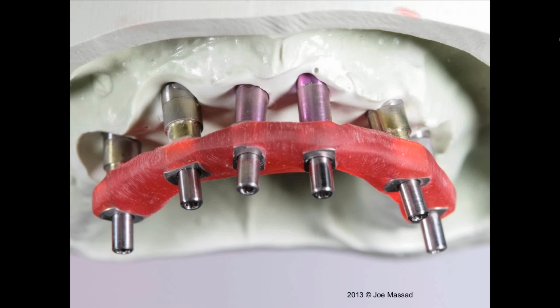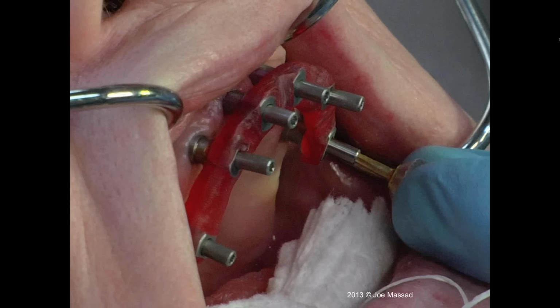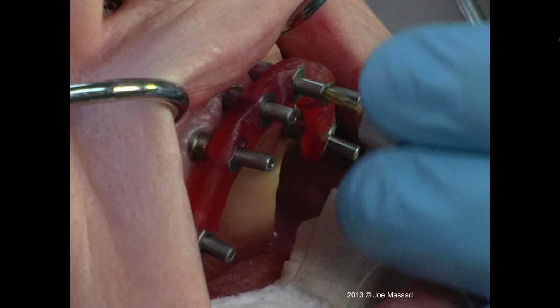Now, as I put each one of these in, I want to make sure I don't feel any resistance. If there's resistance, I will stop, because something's not right, which means you're probably going to have to cut that one particular section and then see if the others go in without resistance. Then you know exactly which one to cut. You don't need to cut all of them if it doesn't fit in the mouth, just the ones where you feel resistance when you're trying to lock in the pin and it feels like it's rubbing up against something.